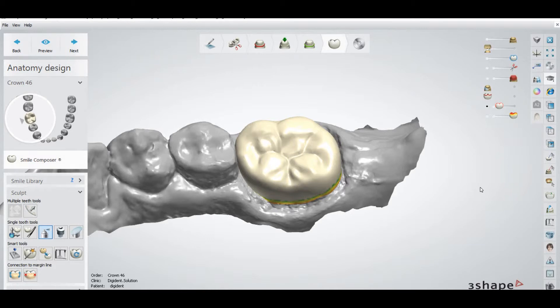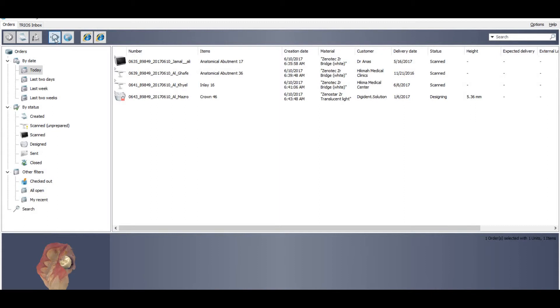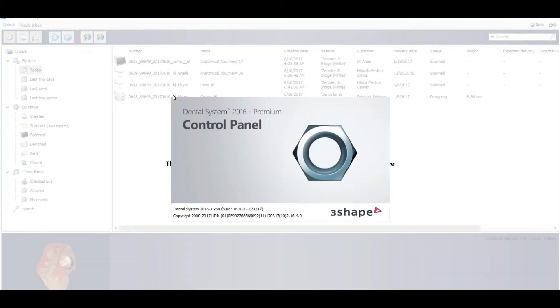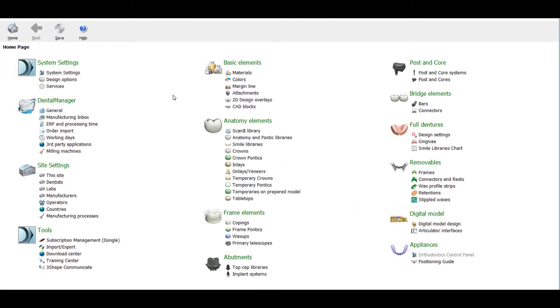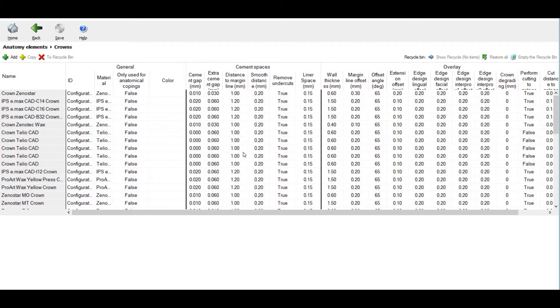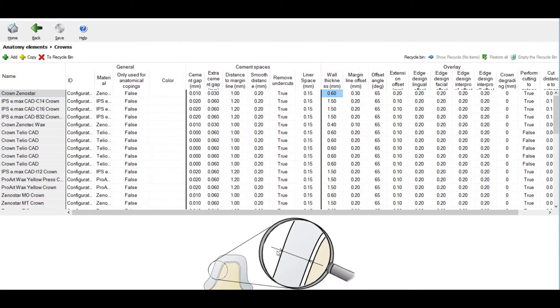How you can change the settings of your minimum thickness by default — you have to go to the control panel. Go to Manager, then go to your control panel. In the control panel, go to the anatomy elements section. You will find crowns — just select this option and you will find tables. On the left side you have the materials, and on the right side you will find all the options. If you want to change the materials, just go to that line and there is the option called wall thickness.